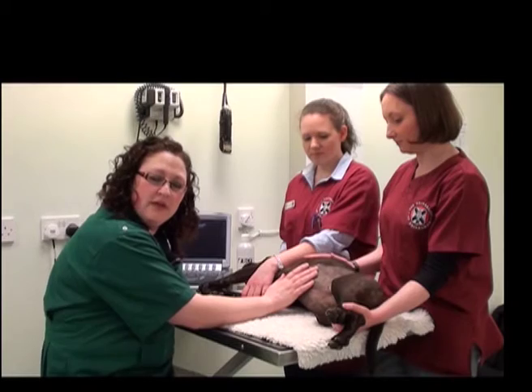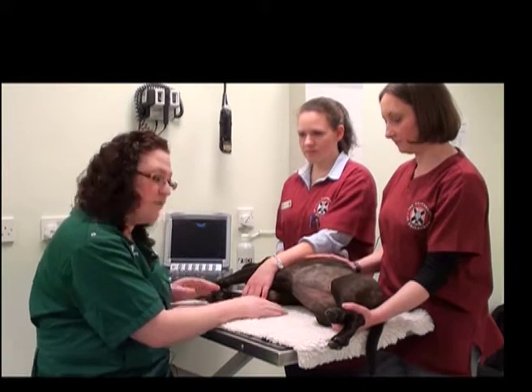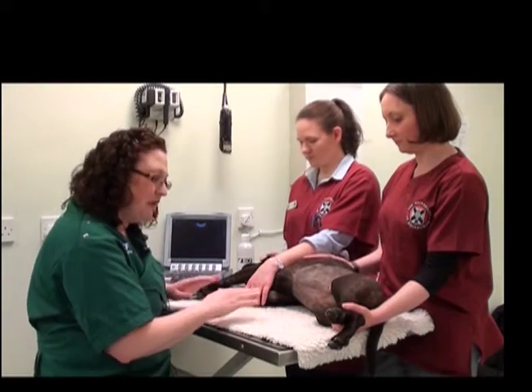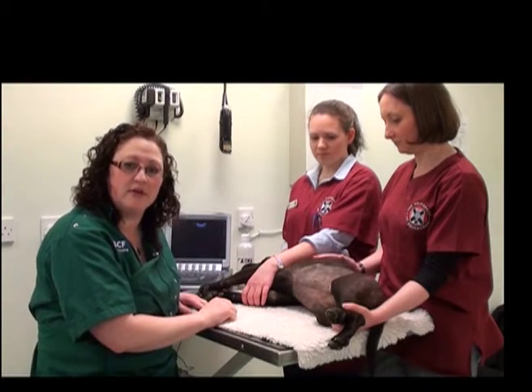The first thing you want to do is make sure that the room you've chosen to perform your examination in — whether that's a dedicated room or a consult room such as this — that you make sure there's not a lot of traffic going through the room while you're performing your exam.